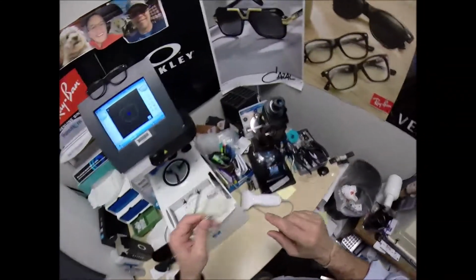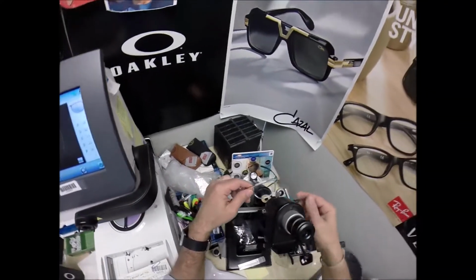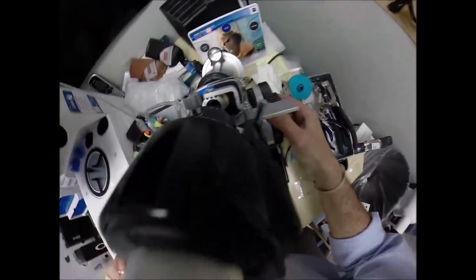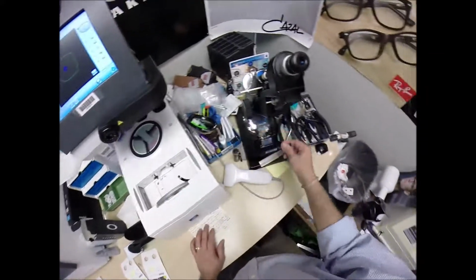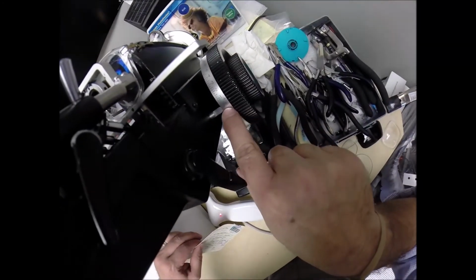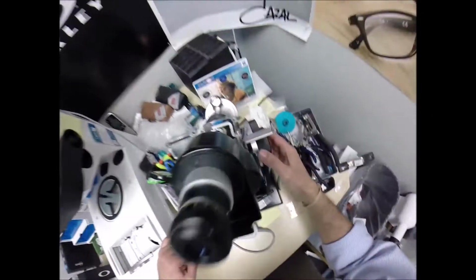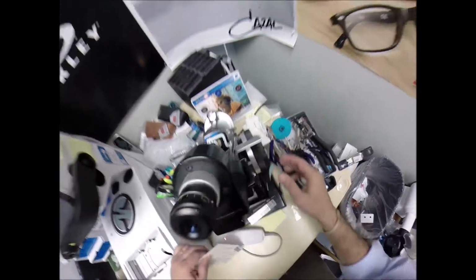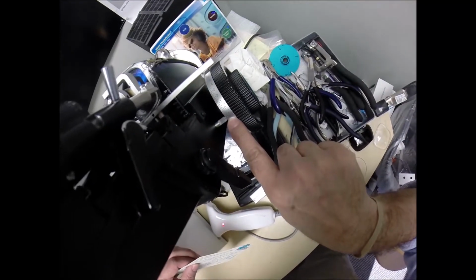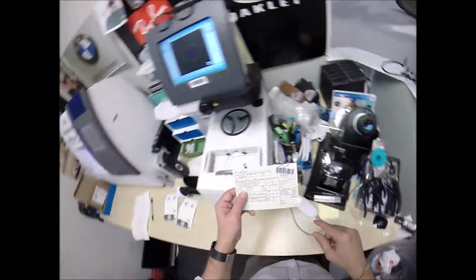Dry everything off a little bit more, put it in over that black dot, turn the axis wheel to 0, which will be called 180 tonight. Read the power. We're getting -1/4 in the red. Pluses are in the black. It's like roulette. Minuses are in the red. Let's check your full diopter of astigmatism correction. We're now at 1/4. Going away from 1 towards 2, -1/4.